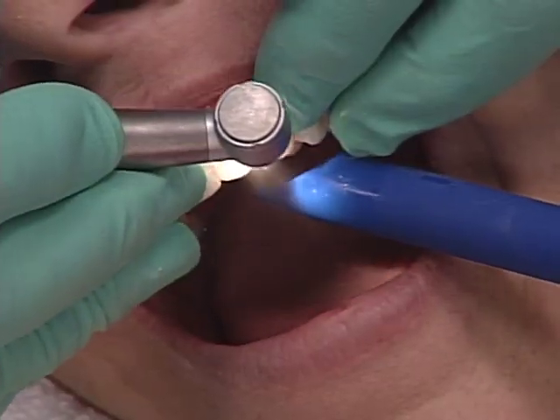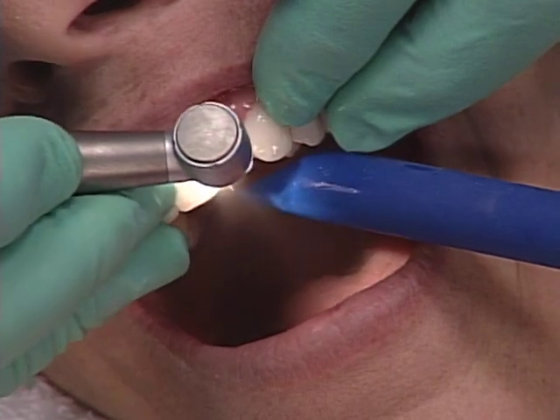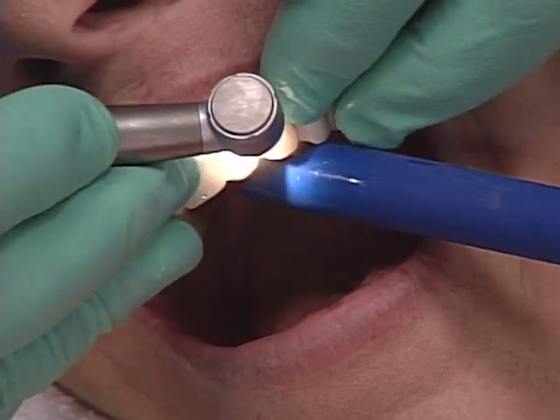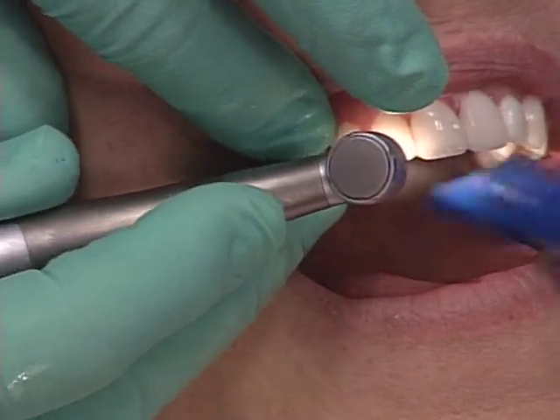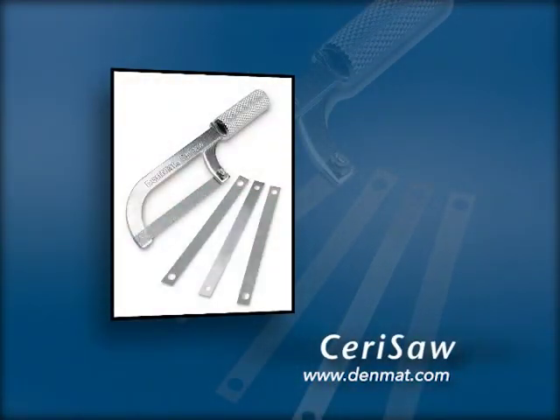So here's what I'm going to do. I'm going to take off the distal of it and the mesial of the cuspid. So I just take that off like that. Now we're going to open the contacts.